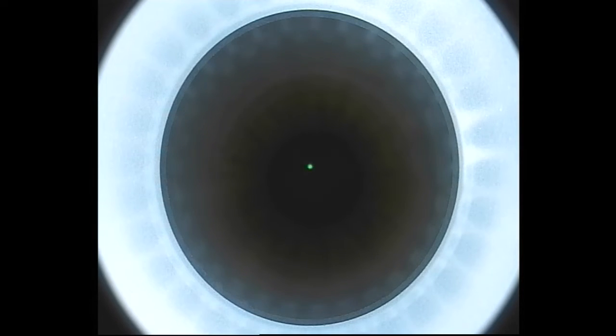Here we are docking the eye with the Visumax. One thing that's nice about the Visumax — I've performed a number of LASIK flaps with this machine to get ready for SMILE — is that patients are very comfortable. The eye pressure only goes up to about 80 millimeters of mercury with the suction, so they don't lose fixation, they don't lose vision, and more importantly they're very comfortable. They don't squeeze like with some of the other femtosecond platforms.